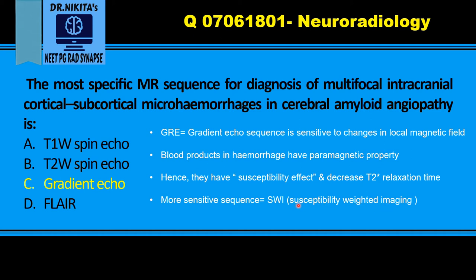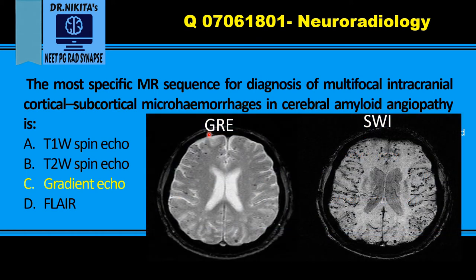Susceptibility means susceptibility effect — that is changed magnetic field due to blood products. SWI is more sensitive than GRE for hemorrhage. Looking at the images of gradient echo and SWI in this patient of amyloid angiopathy, these tiny black areas are the micro hemorrhages. We can see that in SWI, much more hemorrhages are seen as compared to GRE. Hence SWI is much more sensitive than GRE for micro hemorrhages.